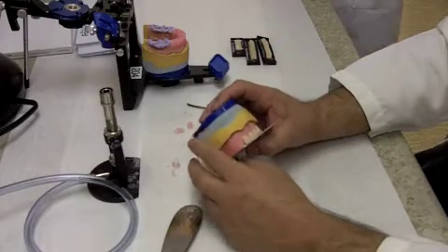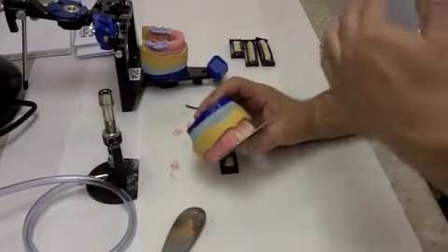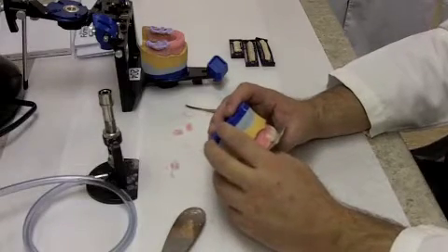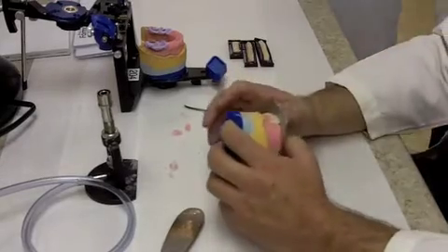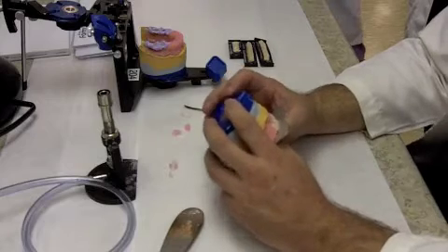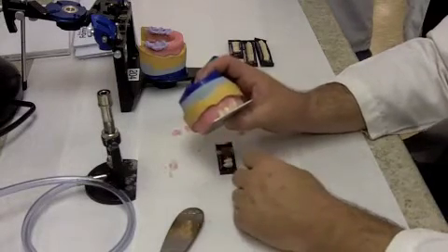Sometimes you can put a little wear on the cusp tip of the canine. I would either set it slightly long to begin with and then adjust it down to get rid of the cusp tip and shorten it back to the plane, or you can just artificially shorten it at the very beginning and then place it down on the plane. It's usually about the same level as the central incisors, so just like you have the central incisor incisal edge touching this plate, the canine should be also.